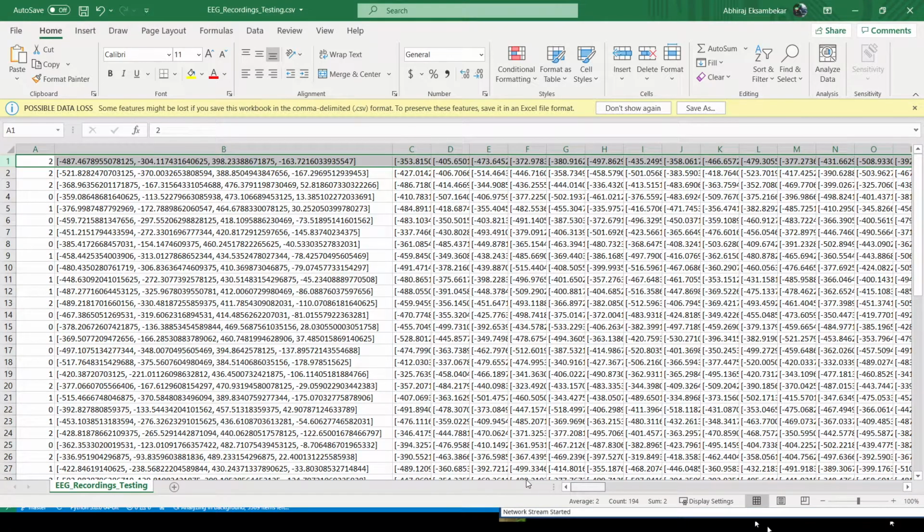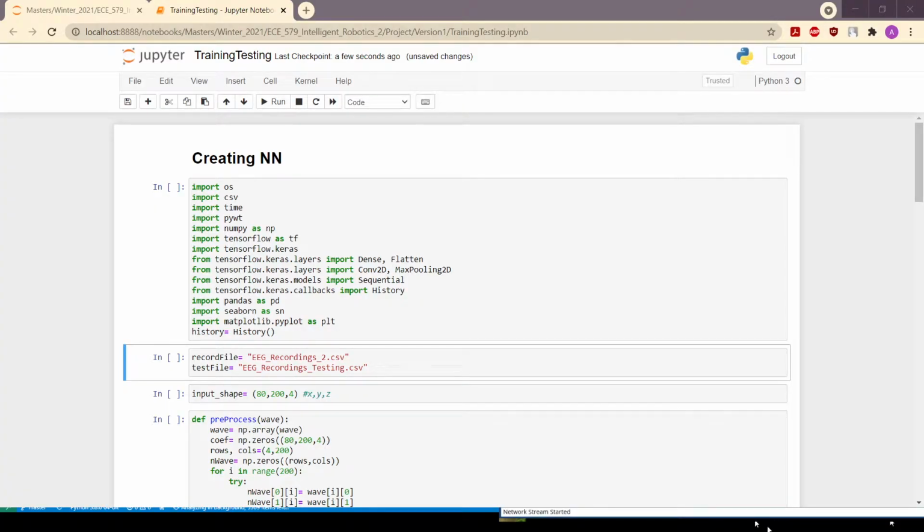And using these recordings, we train a neural network. I'll show you how we train it in just a second. So this is a Jupyter notebook here to create a neural network and train it.